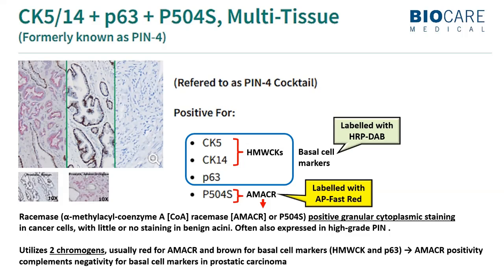In such cases, it's better to leave one unstained slide in the middle of the 2 cuts, which you can at the same time test for the presence or the absence of all these 4 markers just with a single antibody cocktail. So that's why this particular marker is of diagnostic importance in prostatic pathology, especially in true-cut biopsies.